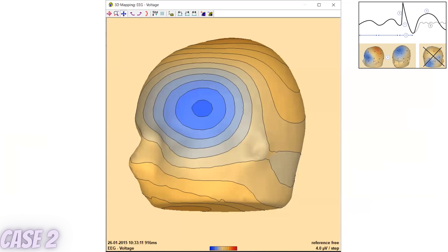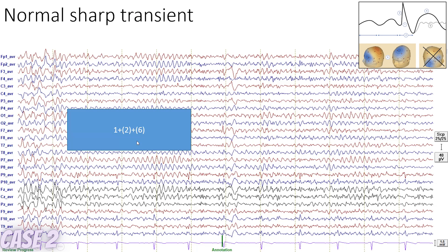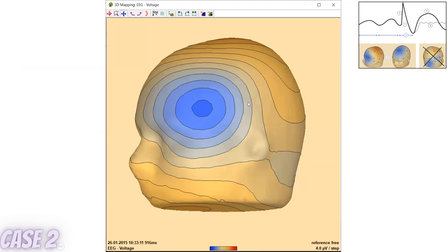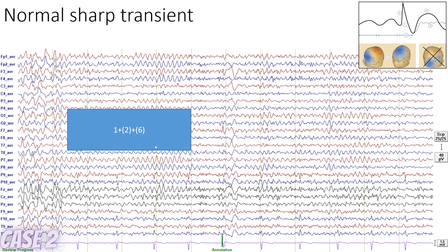Let me show you the voltage map. Looks like it's from the brain. One point. Yeah, indeed it's probably not the nicest one, but it looks reasonable. Let me tell you what the experts rating this told. They also said this has number one - it's spiking. Not the majority, some said that number two, the different wavelengths, is also there. I would agree with you guys - I would not call this wavelength different than this. It's just a pop-up of the beta activity here. Again, this is not the nicest voltage map, but it's still acceptable. So at most three.